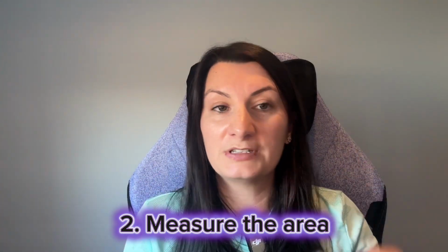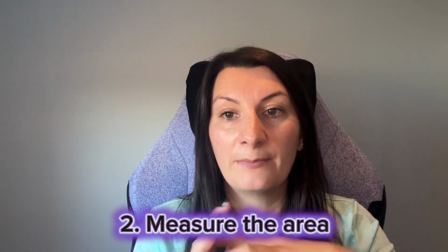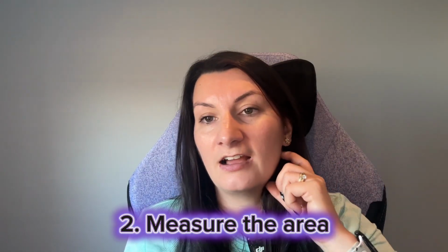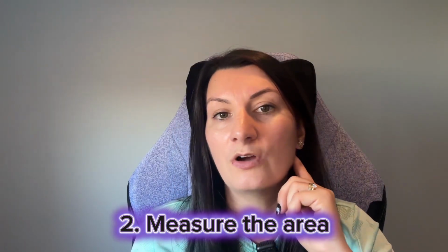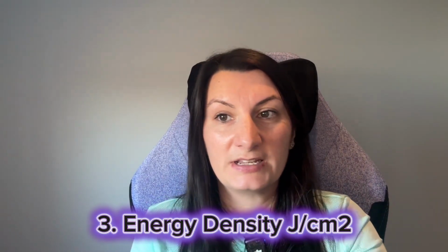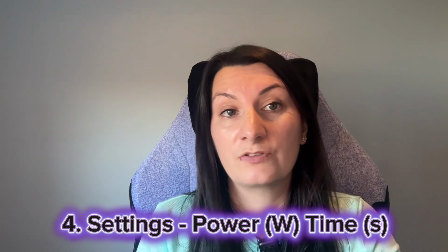If it's a wound, it's the wound and then 1 to 2 inches around that bed. If it's the ear, it's the external ear and the internal ear as well, underneath. So we need to look at the size of the treatment area. Then we need to determine the desired energy density, that's your joules per centimetre squared, to get to your total joules. And then finally, your settings, so your desired power that you're going to use based off the machine that you have.